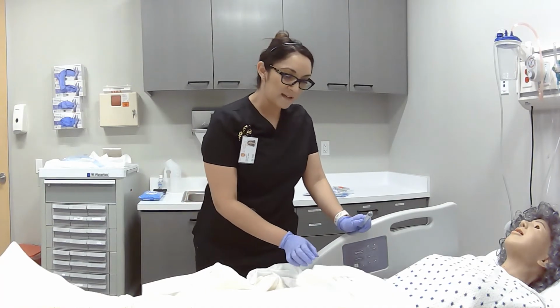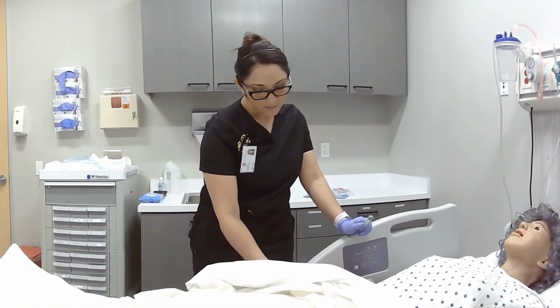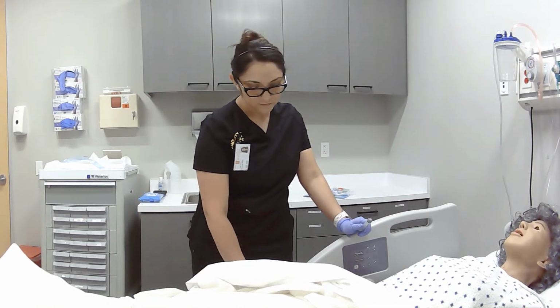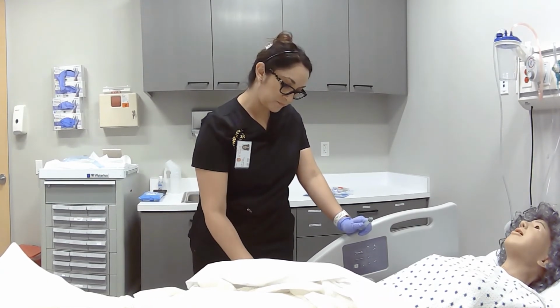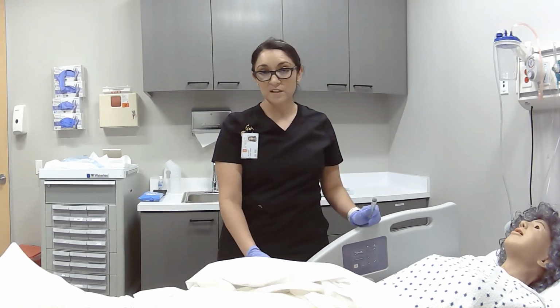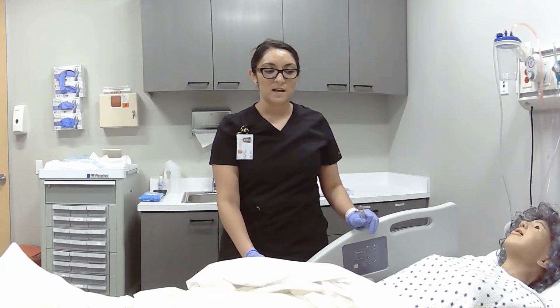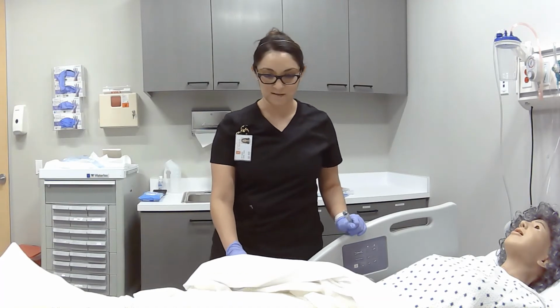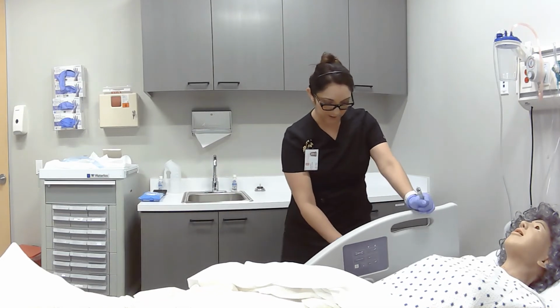And then Miss Adams, I'm going to verify your name and date of birth. Can you please tell me your first name and your last name and your date of birth? Daniel Adams, December 17th, 1971. Okay, perfect. And do you have any allergies? No. No? Okay. So for this particular part, we're not doing anything or exposing her to any allergens, but again, as a standard rule of thumb, always verify their allergies as well. Alright, Miss Adams, so what I'm going to do is I'm going to put your bed up.